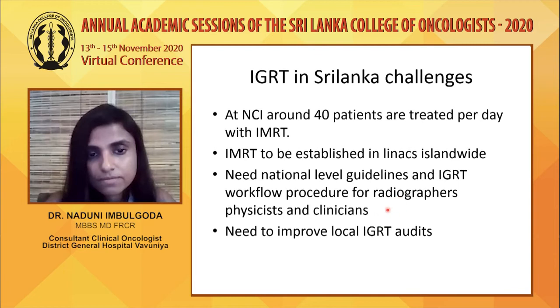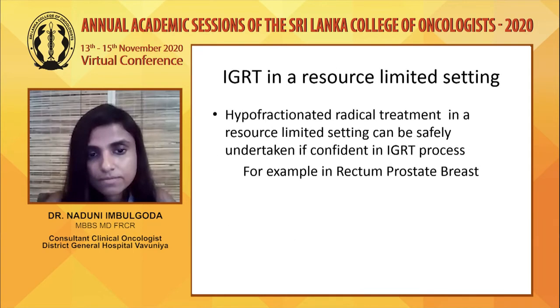We also need to improve the local IGRT audit. And what are the problems of IGRT in a resource-limited setting in Sri Lanka? Well, one solution is that hypofractionated radical treatments can be used, so we can save a lot of money when we lack resources. But when you're delivering treatment in fewer fractions, we need to be very confident that we have good image guidance techniques, so that the dose we delivered is actually given to the patient.